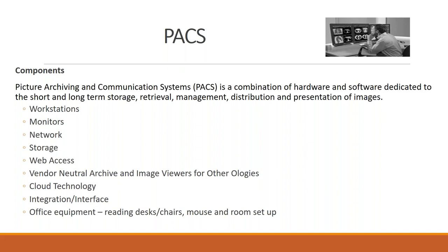Integration basically means something is built within it, so that if you click on a particular button, it launches a program. It's built in, it ties in seamlessly. Interface means they talk to each other, they pass information back and forth. These are two key points that you're going to want to keep in mind. One of the very basic pieces as you're entering into projects is the difference between integration and interface.